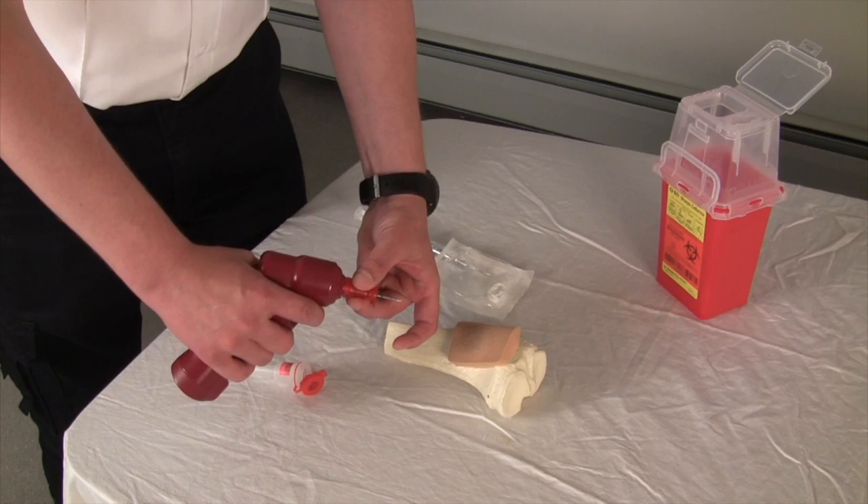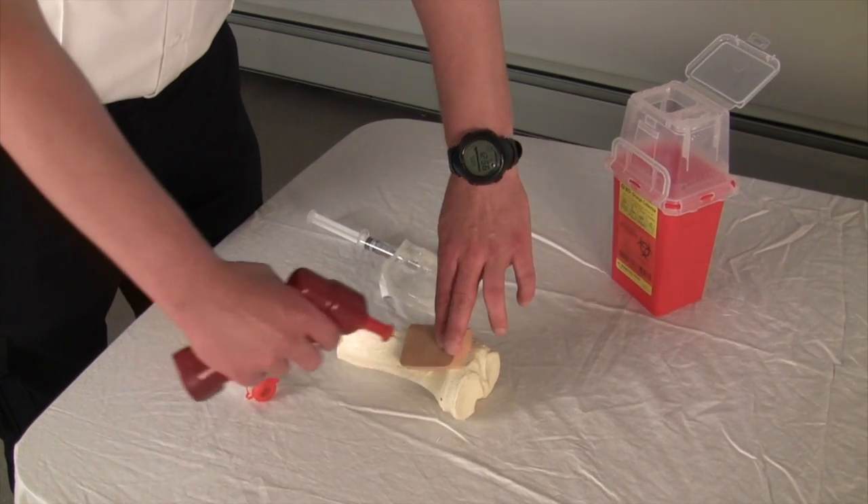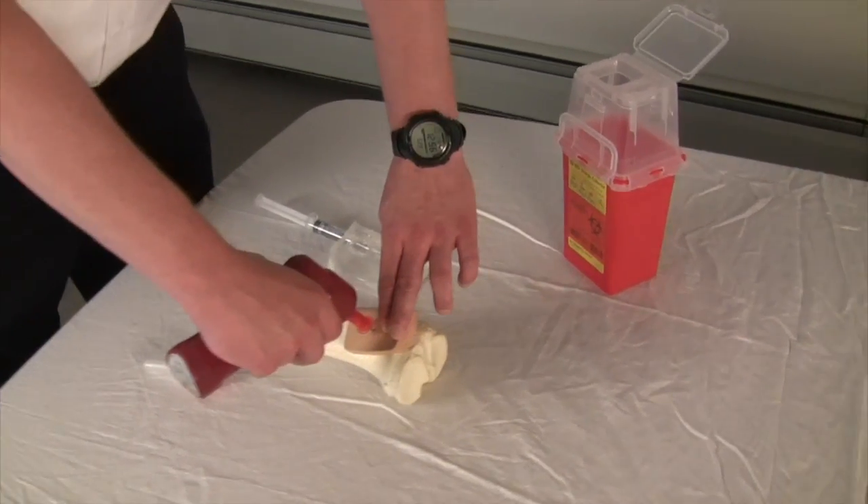The needle is placed onto the drill, inserted through the skin, and when resistance is met, the drill is activated to place the needle through the bone itself.